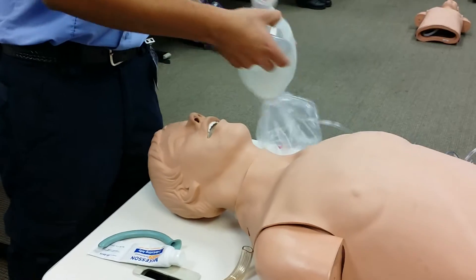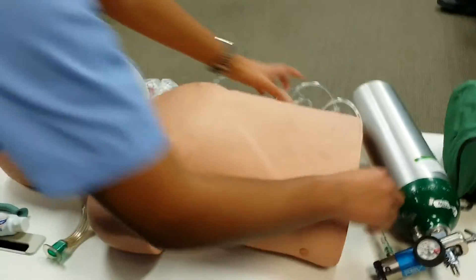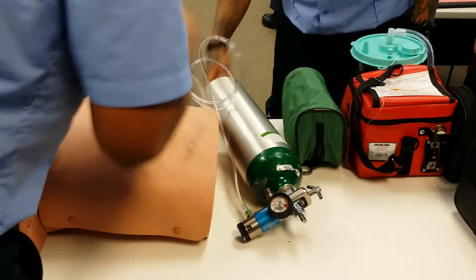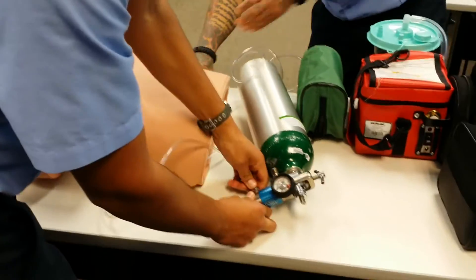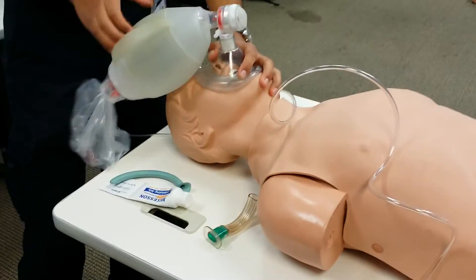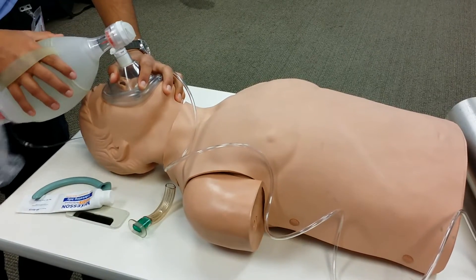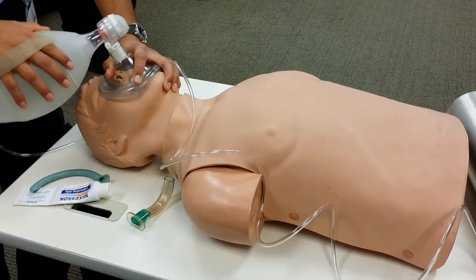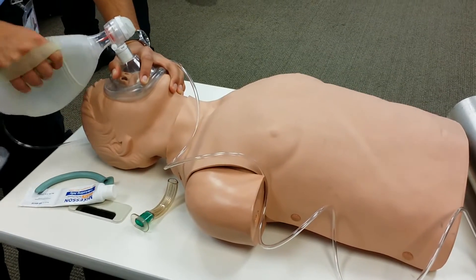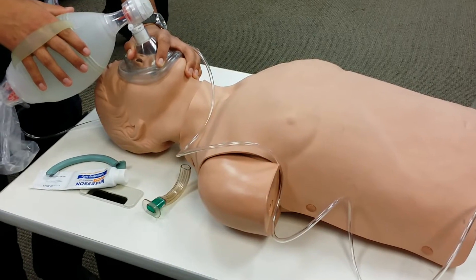Then I'm going to begin rescue breathing. I'm going to make sure my BVM is connected. Whatever my regulator goes to, it's going to be at max — the max on this regulator is going to be 25, so 25 liters per minute. Head tilt chin-lift. I'm going to begin rescue breathing: one — one one-thousand, two one-thousand, three one-thousand, four one-thousand. Two — one one-thousand, three one-thousand, four one-thousand. Three — one one-thousand, two one-thousand, three one-thousand, four one-thousand. Breathe.